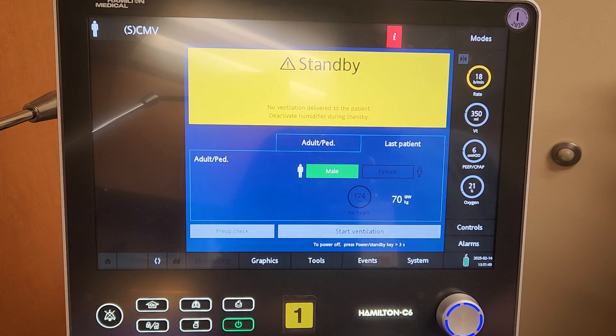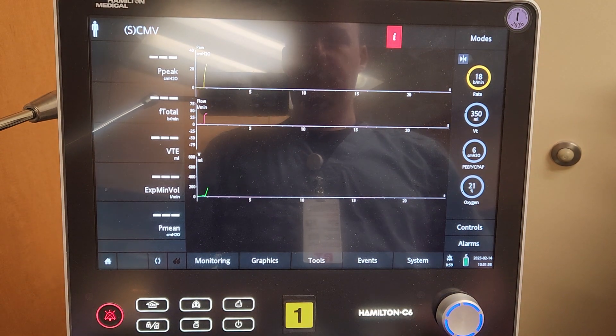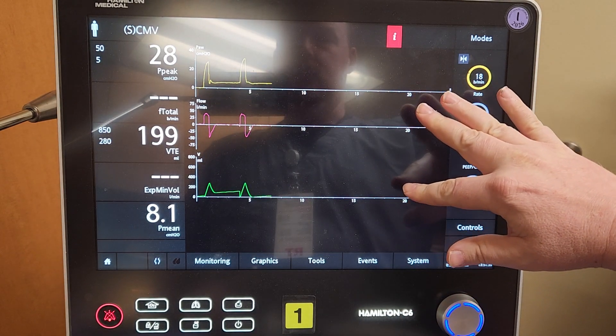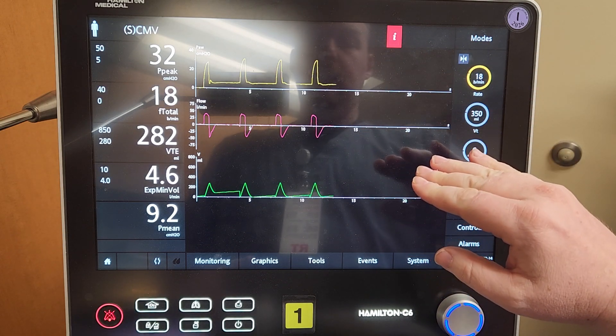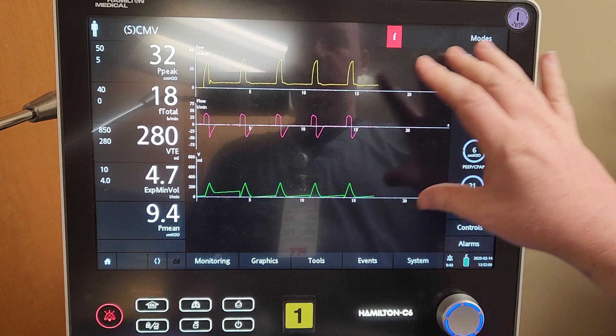Let's get started with some button tidbits. I'm going to start ventilation. The most important thing is noticing that we do have waveforms here — the pressure, the flow, and the volume ones. These will identify if the patient is ventilating and how well they are doing.